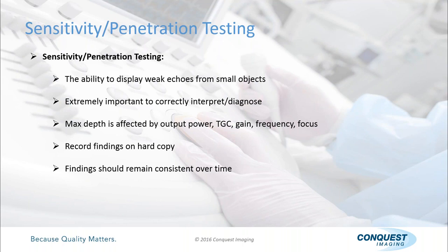And then it's important that you record, as I mentioned earlier, all your findings on hard copies. If you have a printer, print it out, leave it with the system, maybe make a copy for yourself so that if they get lost, you have something to refer to. What you're really looking for is that these findings should remain constant. There should be absolutely no degradation over time.